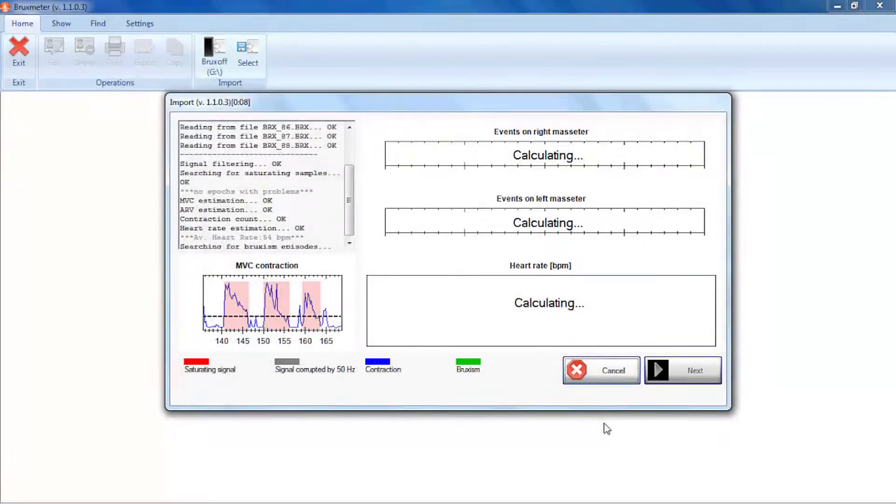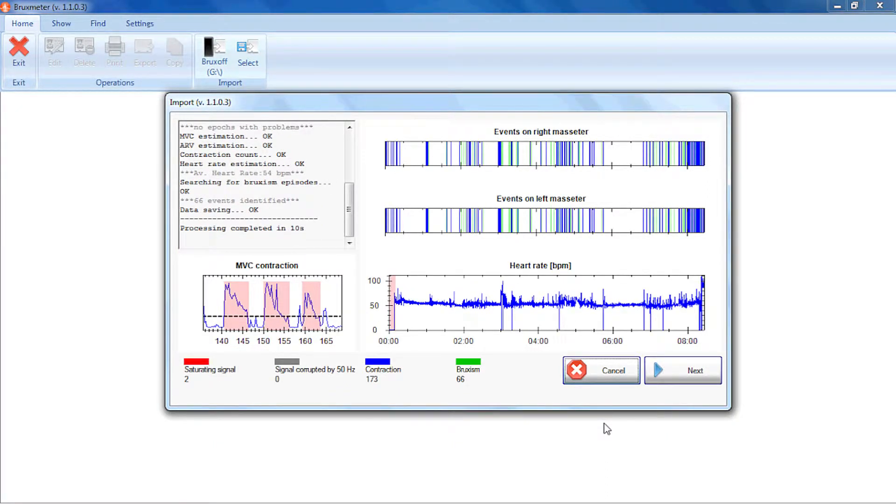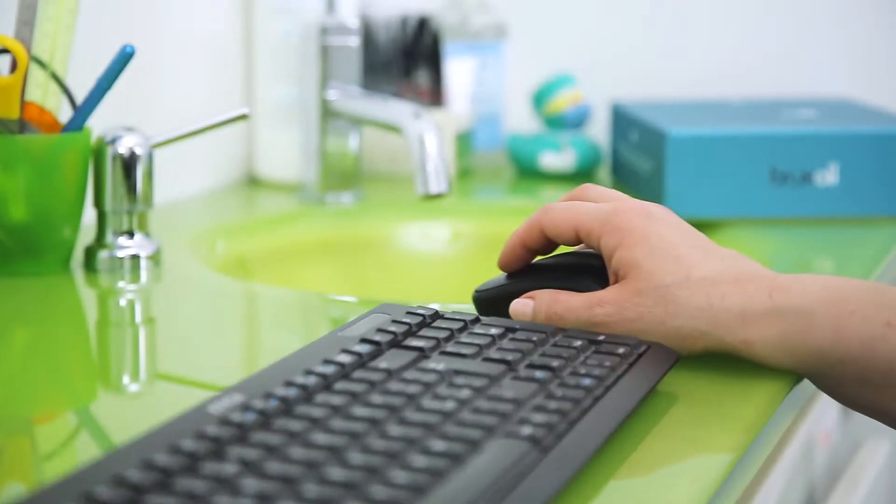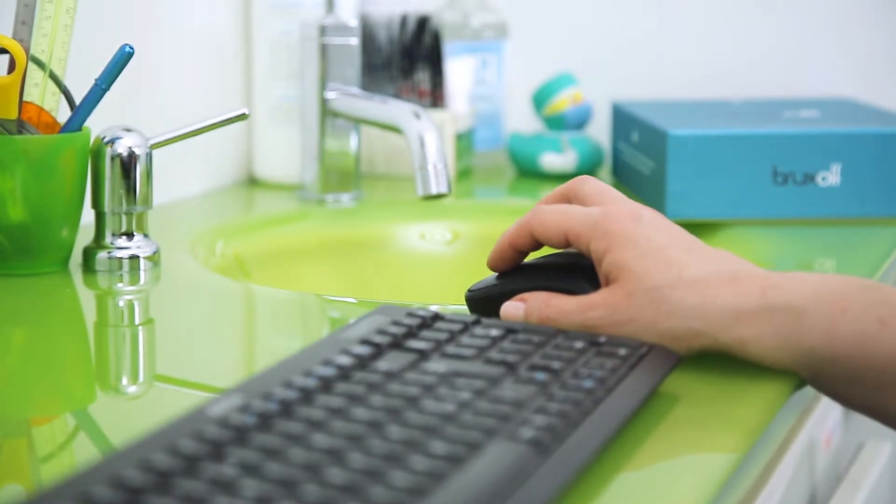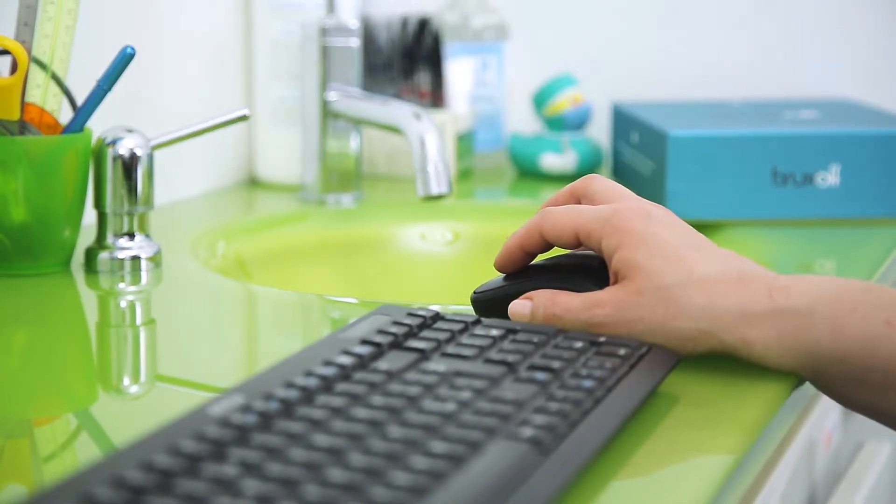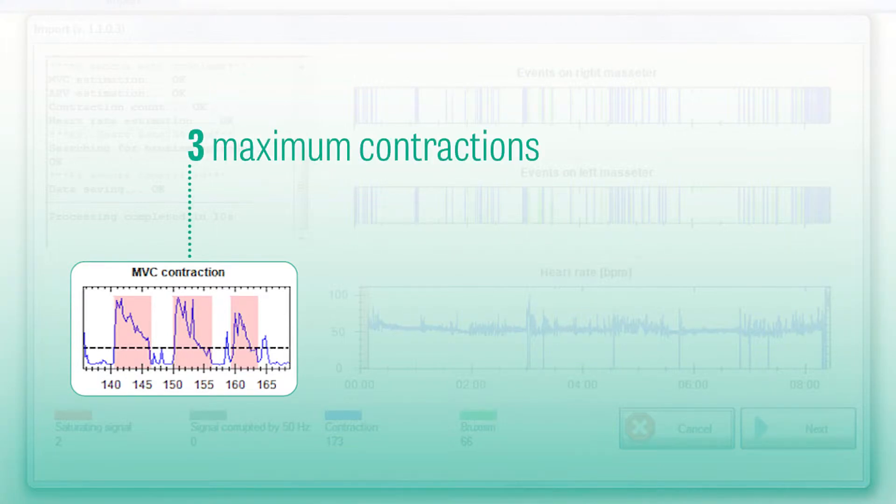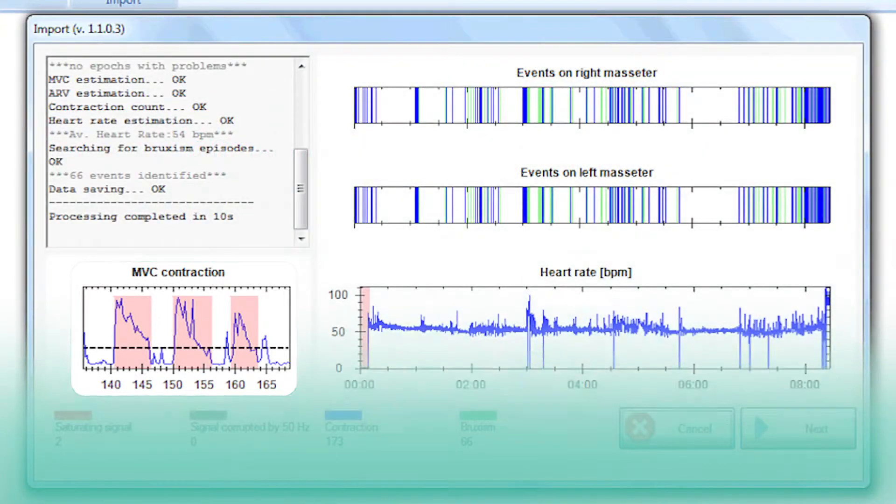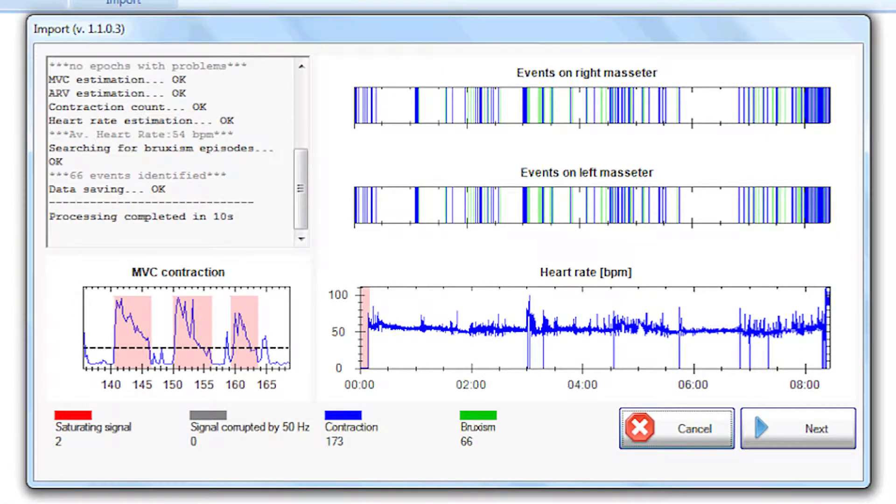The Bruxmeter software searches the data for activation of the masseter muscles and classifies these instances as contractions. The processing algorithm searches for three maximum contractions in the first three minutes of recording. The maximum activation by the patient determines the limit for identifying contractions of the masseter muscles.